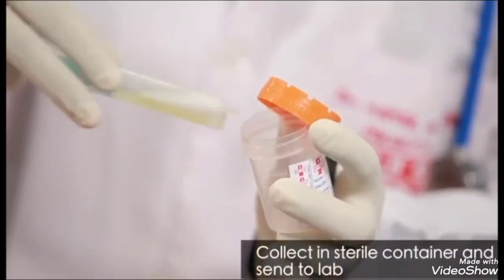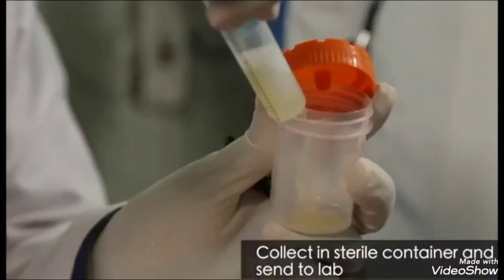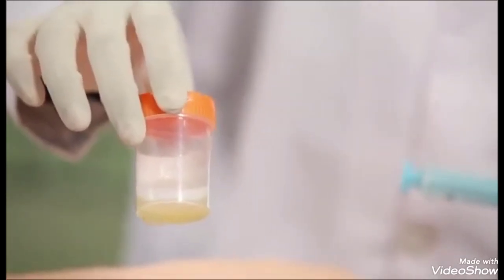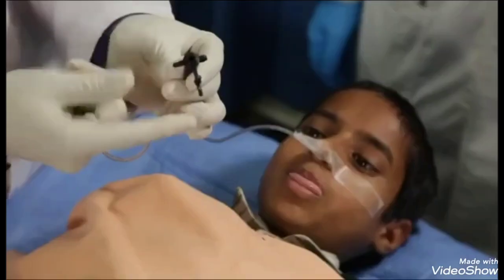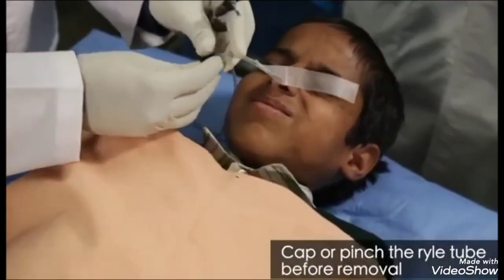Collect the aspirate in a sterile container. A specimen is considered adequate if it contains about 10 to 15 ml of stomach contents. After collection of gastric aspirate, gently remove the tube by closing its cap or pinching the tube.